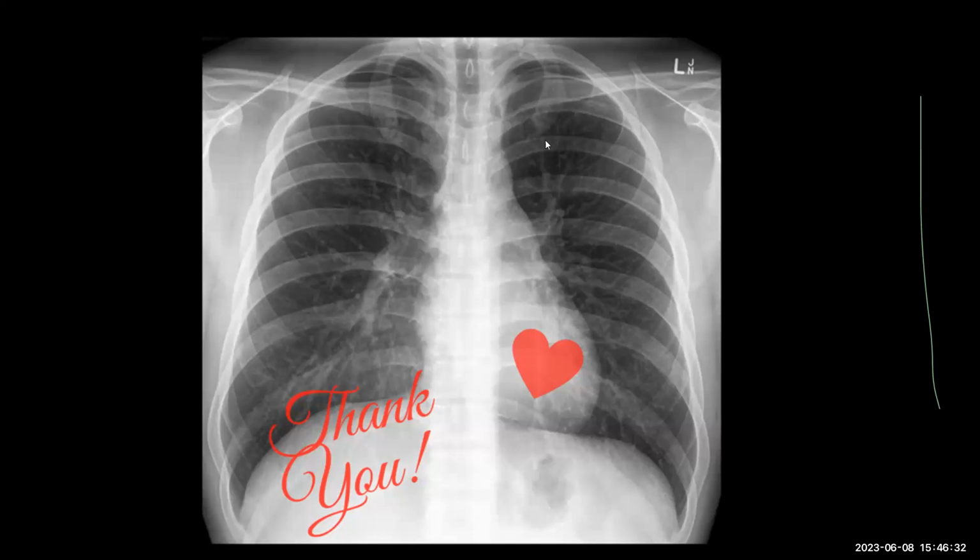Dr. Rayyan, I have two questions. Can you explain how you do the dynamic MRIs? And the second thing, as a pain physician, we do get a lot of information on the MRI without contrast. So when should we get the MRI with contrast? Is there any particular situation that we should be aware of where we should get an MRI with contrast?